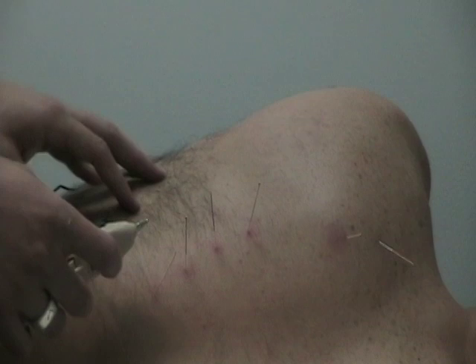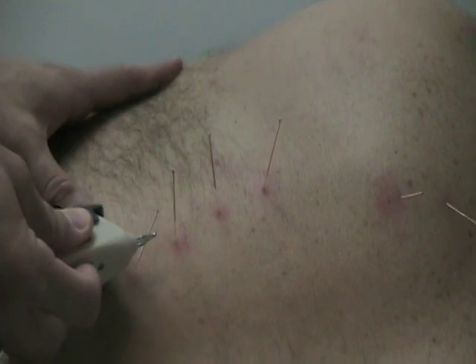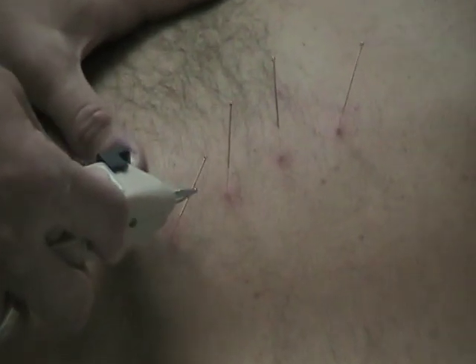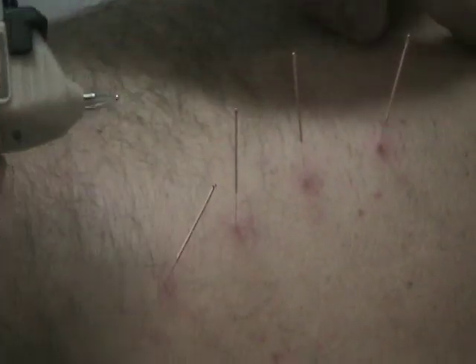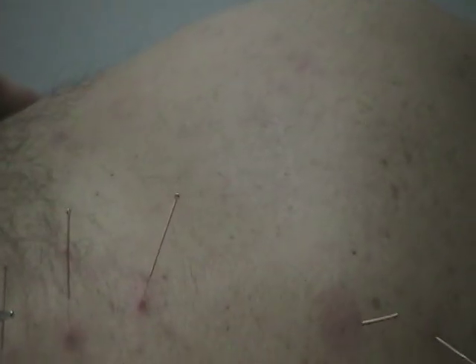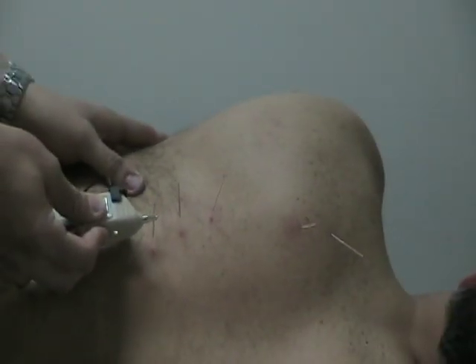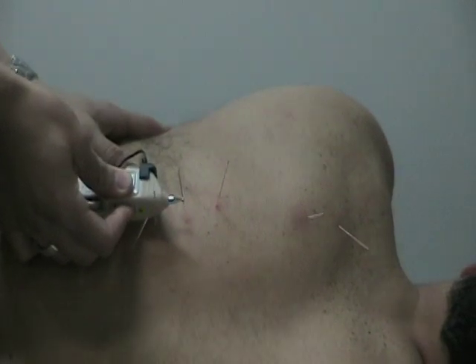I'm using a pointer plus stimulation unit — if you can zoom in you can probably see some contraction. By using the pointer plus unit it can cause some contraction in the muscle. You can see the effect it's having on the scapula, how it's drawing it down. We don't want to do it for too long; we just want to do it enough to get that motor innervation activated for the rehabilitation.